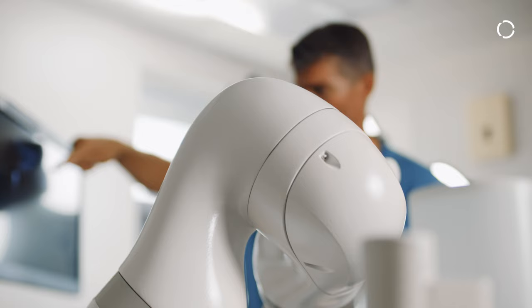We did a study to look at interaction between the patient and the robot, and some patients actually preferred being scanned by the robot. Most patients felt it was quite intuitive to interact with.